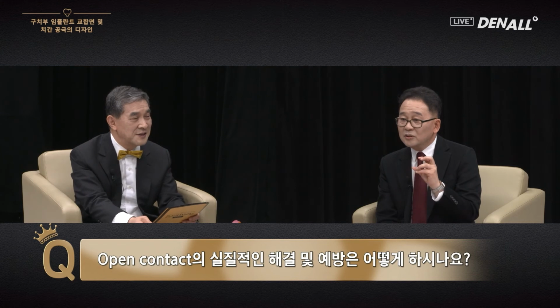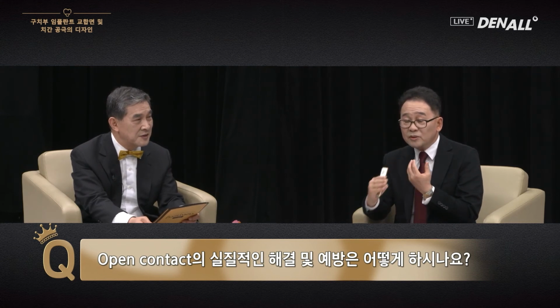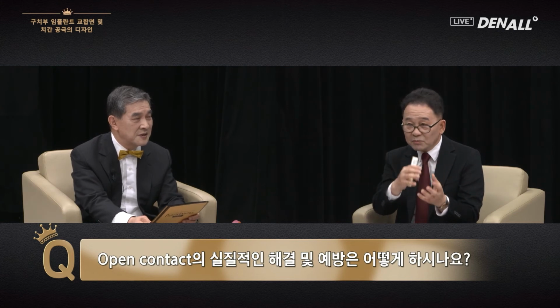As you know, sometimes we need to retrieve the implants and they fracture and the food impaction can occur, and we need to clean them. So as a prosthodontist, I prefer the screw type because of the maintenance. I can be considered by young dentists as a member of an older generation.